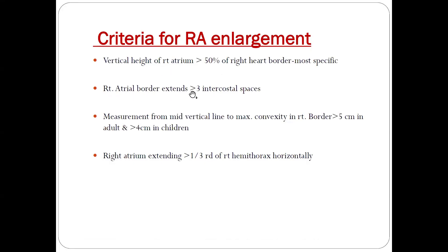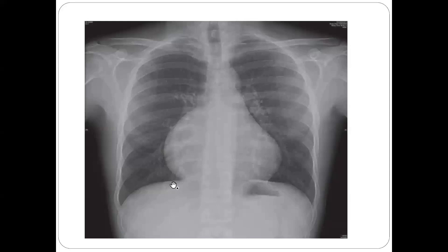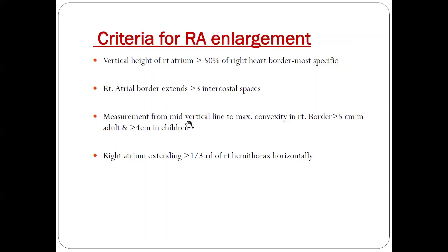Second criterion: a right atrial border extending more than three intercostal spaces. Here you can see the right atrial border covering one, two, three, four — almost four intercostal spaces. Since it is more than three intercostal spaces, it again denotes right atrial enlargement.